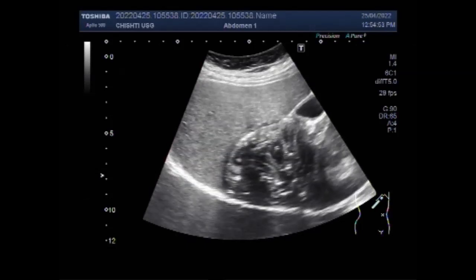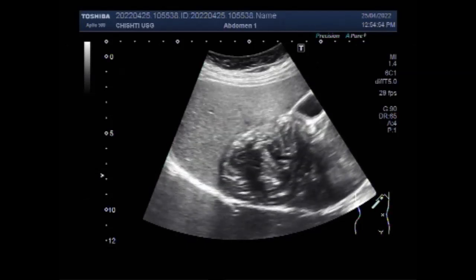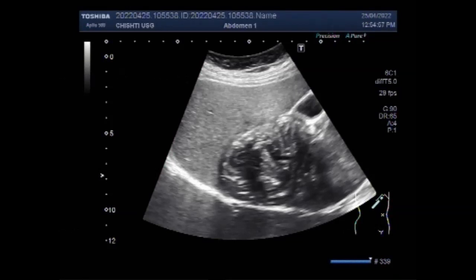Daughter cysts with echogenic material between the cysts — the appearance can vary and may show a double echogenic shadow due to the pericyst. The stage of the cyst may be classified on ultrasound.